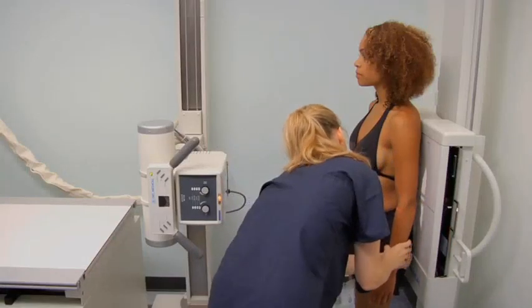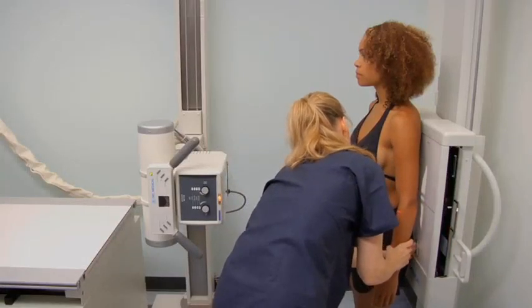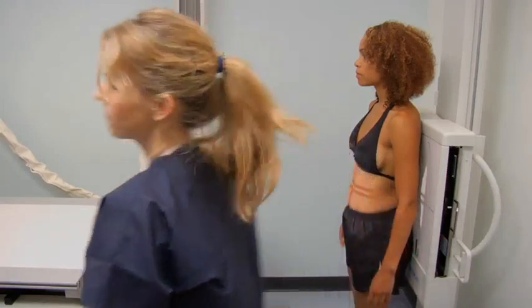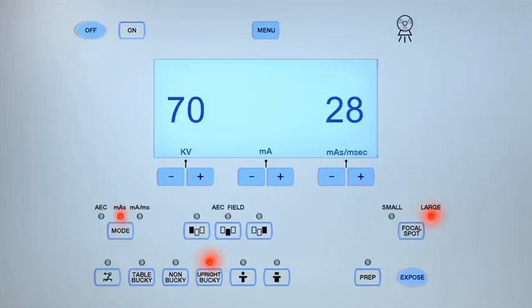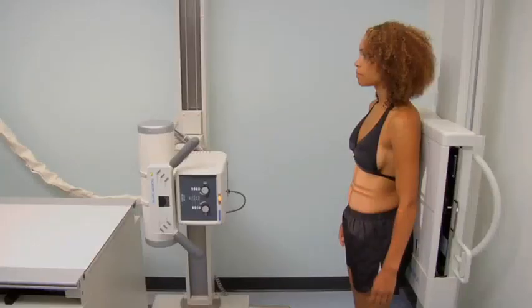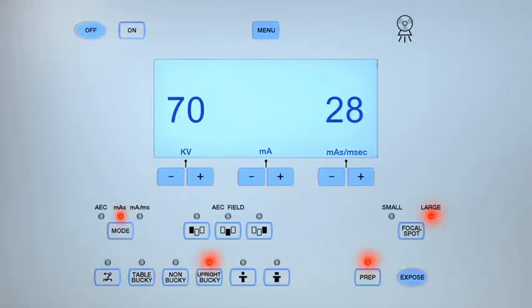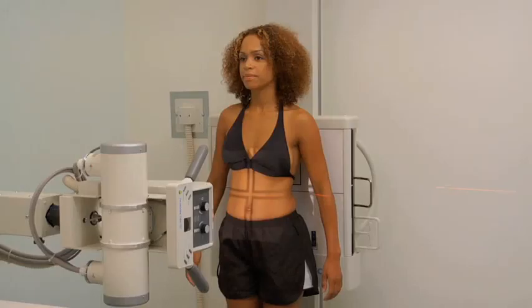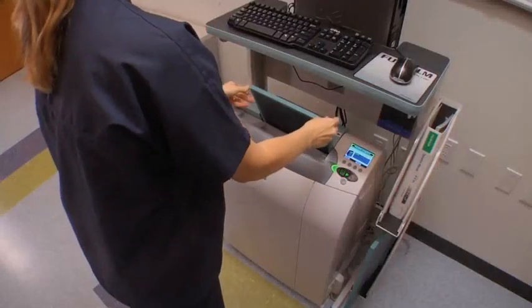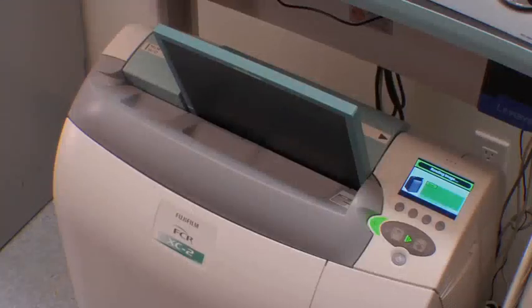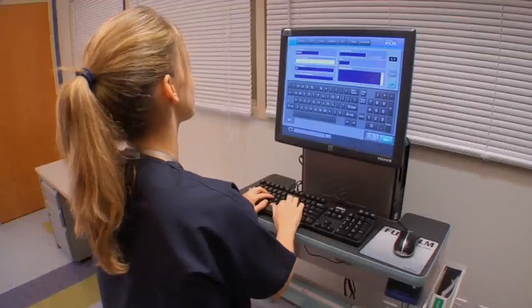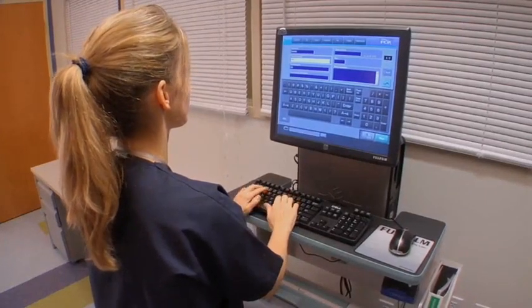Position the lead marker within the collimation field and then move behind the protective lead barrier. Check that the exposure technique is appropriate for the patient's body habitus. Ask the patient to breathe in, then out, and then to stop breathing. After exposing the cassette, inform the patient that they may relax and breathe normally. Remove and process the cassette. Move on to the next projection or review the images if no further radiographs are required.